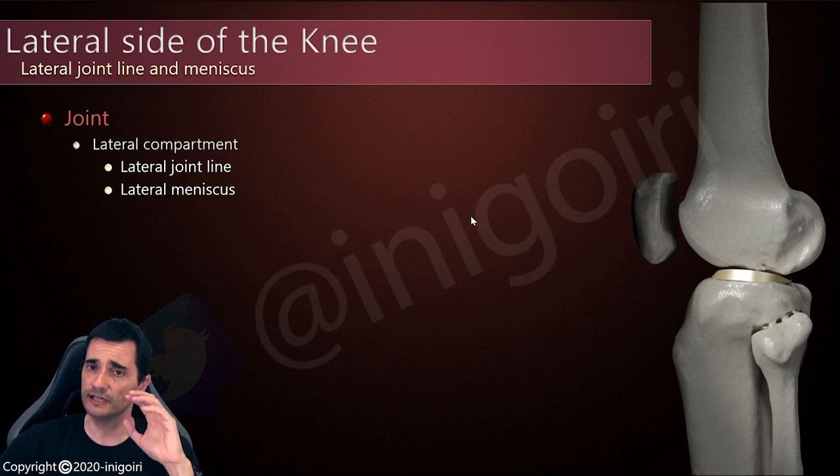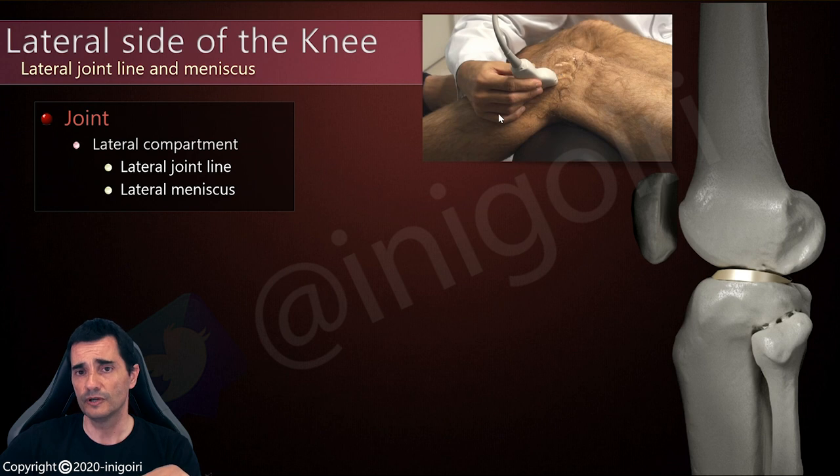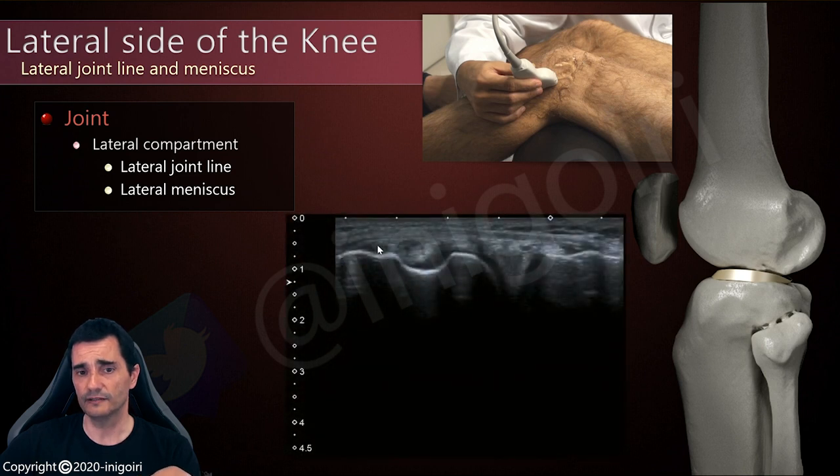As I always say, the lateral meniscus is not well assessed with ultrasound, but we can take a look and we'll see what happens. To examine this area, I place the probe following the direction of the leg and I locate the joint line. In this position we will find the femoral cortical, the cortical of the tibia, with a small amount of cartilage of the femur and the tibia, and between them the lateral meniscus.